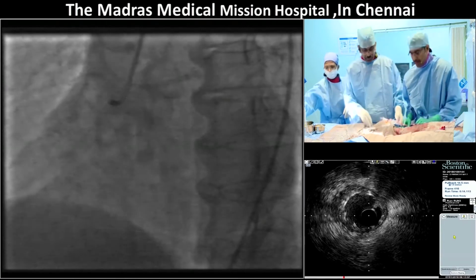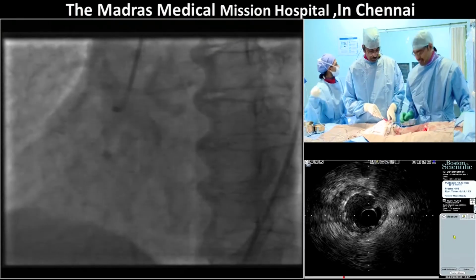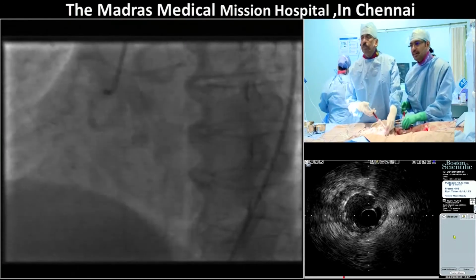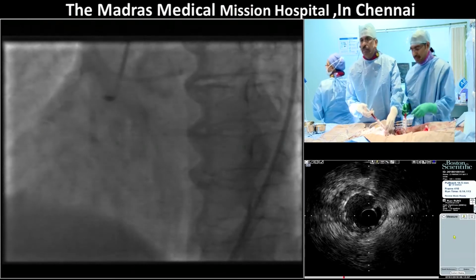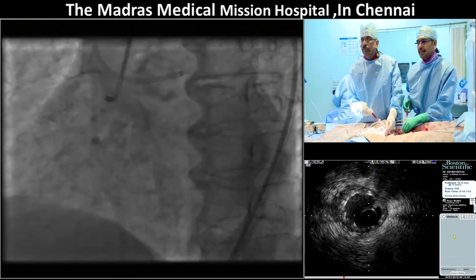Yeah. Okay. So, take some time. Is Dr. Anand there? No. Okay. You want to take a simultaneous? Yes, sir. I will take the antegrade. So Vijay is going to take the antegrade shot, and I'm going to take the retrograde. So don't move the table, please. Don't move the table. Ready, sir? Okay, here I go.